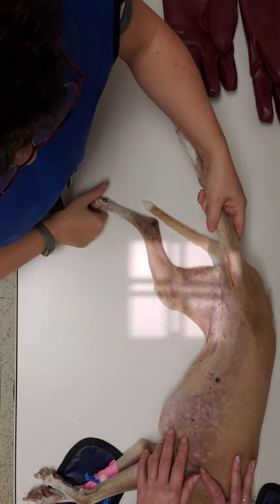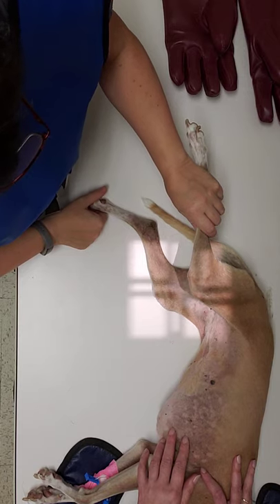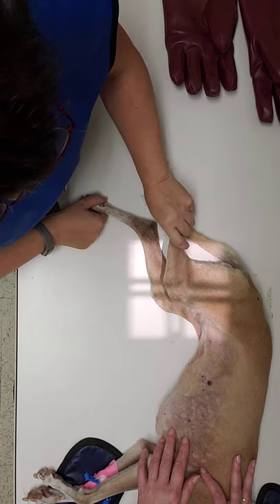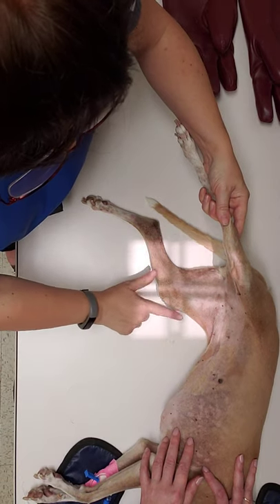The next important thing is you're going to need to pull the top leg up and out of the way. You don't want to cause excess pain to them because typically you're going to be taking both joints, or if they've got bad hips. So take her leg and just lift it and rotate it just a little bit. Now you have full exposure of that knee.